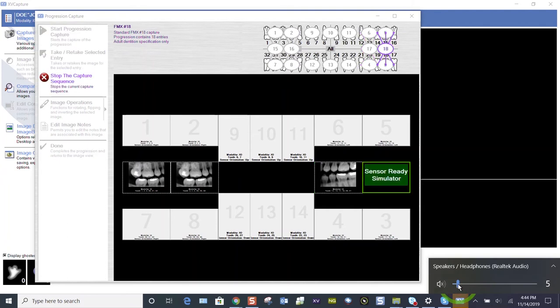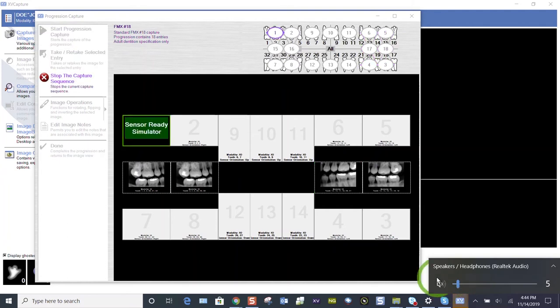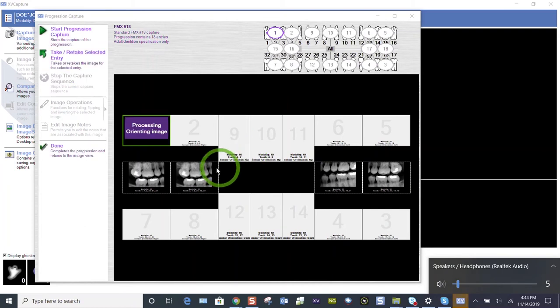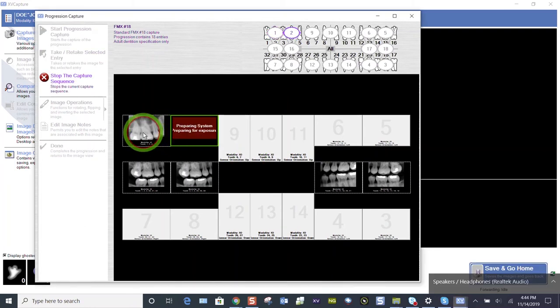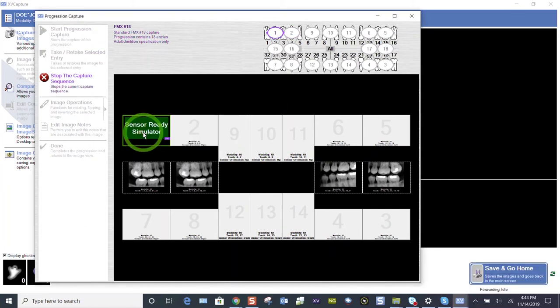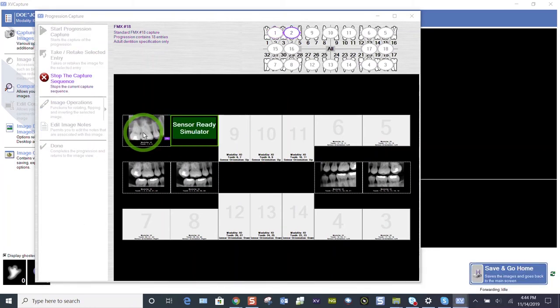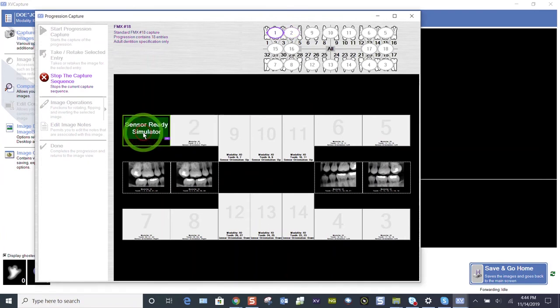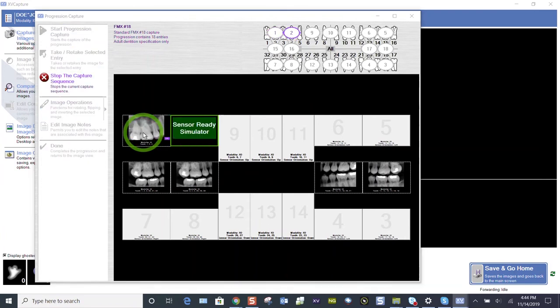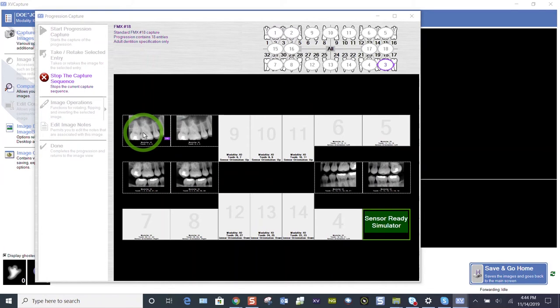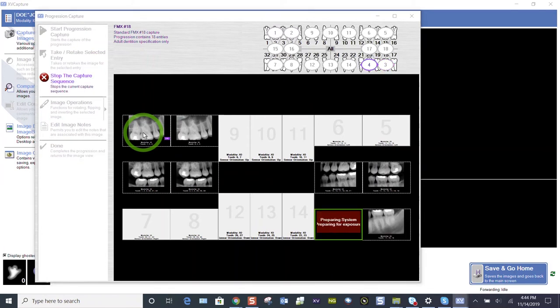Now, if you want to retake an image on the fly, this upper right molar, if it's not correct, I can highlight that tile, take my image again, hope I get the apex. If I don't, highlight the tile, take it again. And when I'm satisfied, it will move on to your next image. So it's that easy to retake an image on the fly.